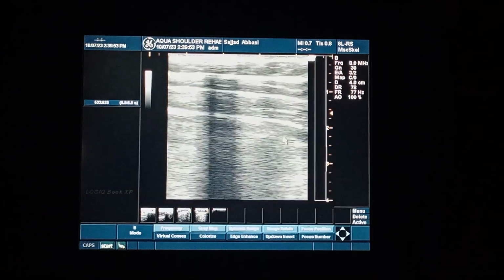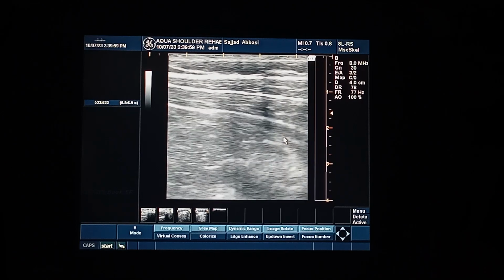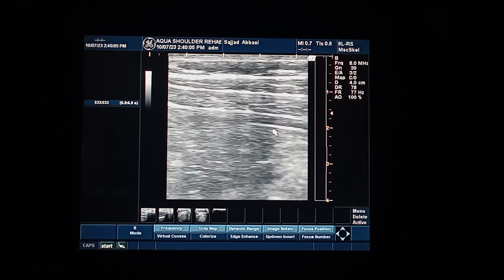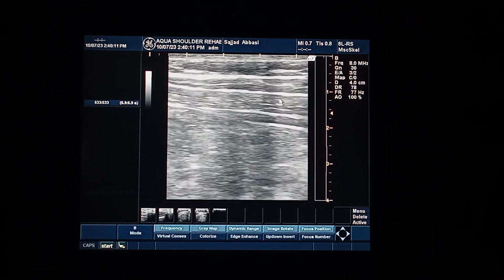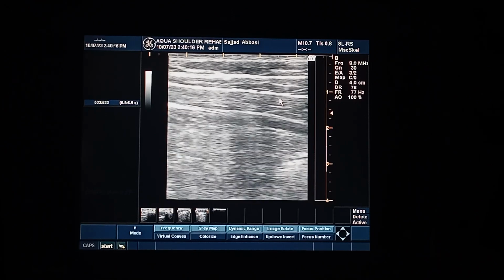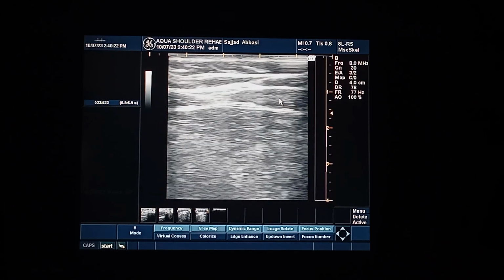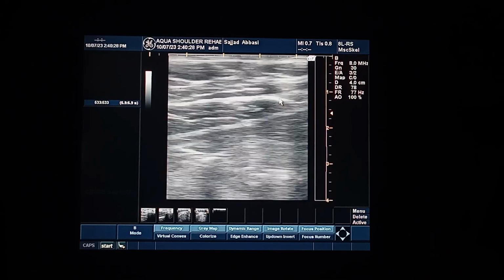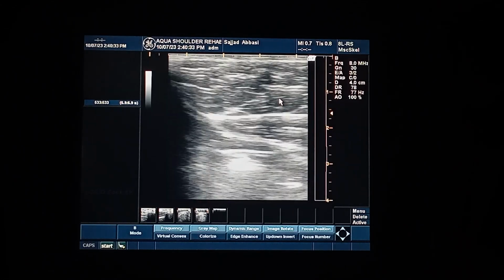So this black line is showing us that there is no ultrasound gel at that particular area. So when there is ultrasound gel, can you see these three muscles? This is fascia, one muscle, second muscle, then fascia, and the third muscle. So I'm just trying to contract my transversus abdominis muscles, and I can easily see the movement of these muscles. So that's how you can identify and see the convergence of all these muscles onto the fascia and then onto the rectus abdominis, and again from the rectus abdominis it is going to the opposite side.